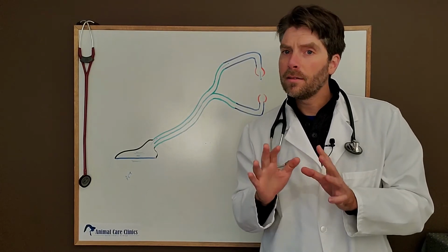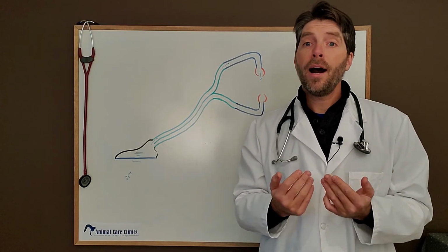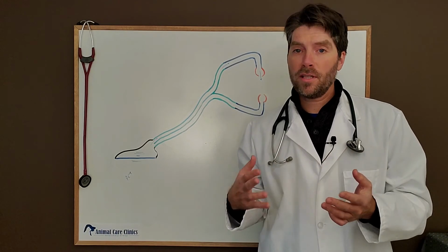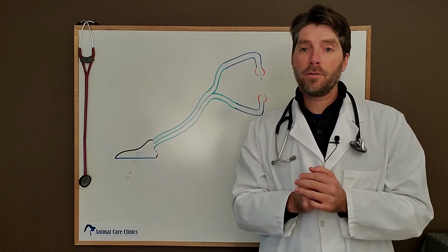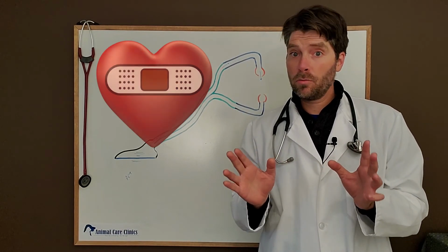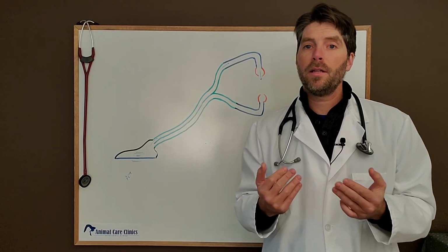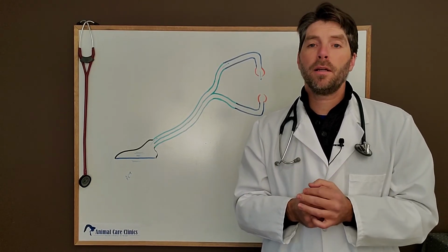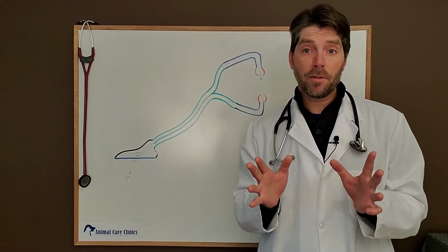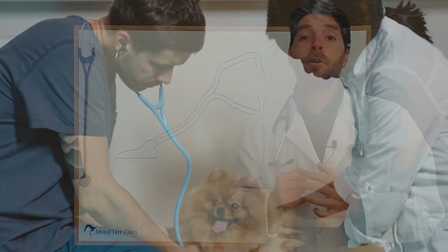Do you hear that? Do you hear the little shh there? It's not quite clear. So in making this video, I actually diagnosed a new heart murmur in my dog. We've since had him worked up. We had the heart ultrasound called an echo, like I said. Turns out he has early heart disease and we're keeping an eye on it, which is really good that we know this. We're going to keep getting him checked every 6 months, and when he needs treatment, we'll start treating him appropriately. Now, if this isn't one of the best reasons or examples for your annual physical exam like we recommend, I don't know what is.